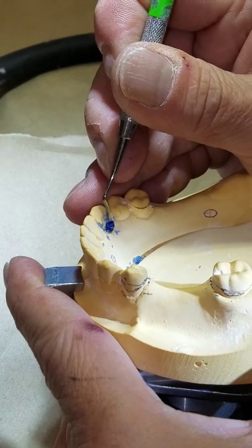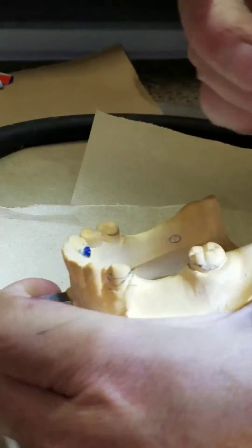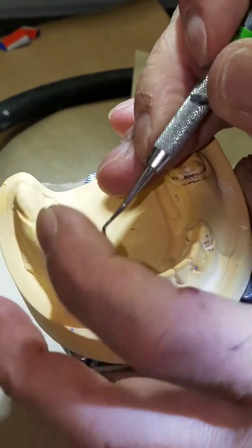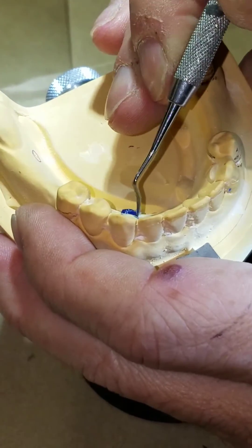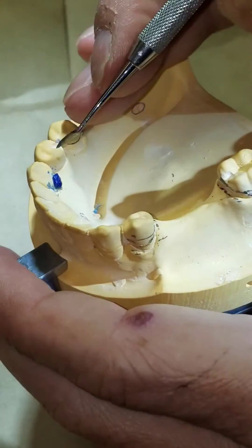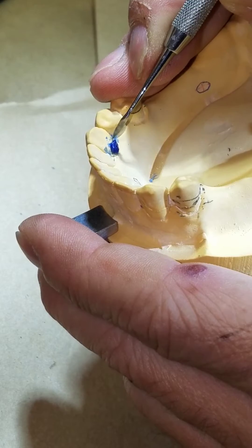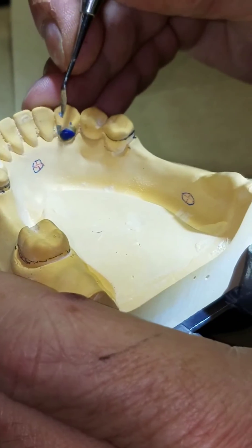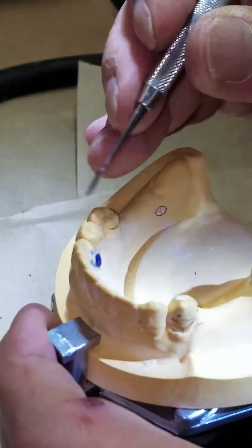One millimeter width of this component right there — like the thickness of it from the tooth surface. The width goes from line angle to line angle. Are you creating your chevron using that carver? Yes. Some of you are waxers, some of you are carvers — I'm a carver. Most people are carvers.